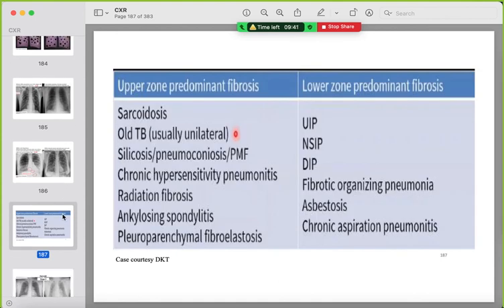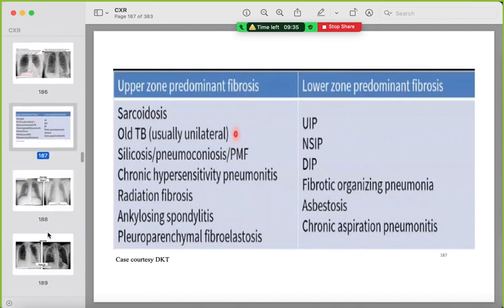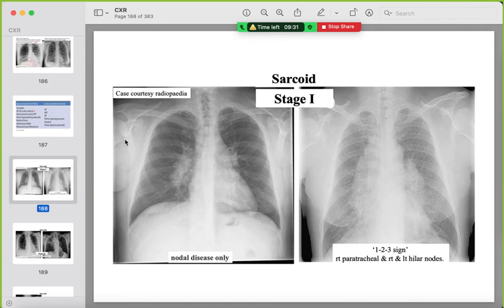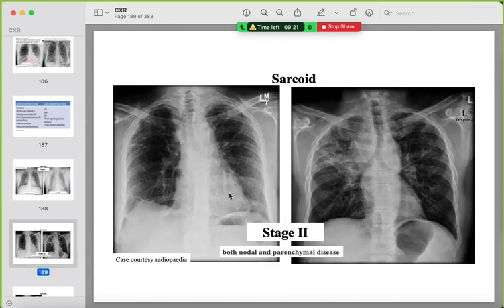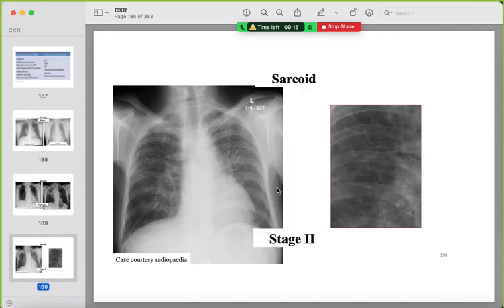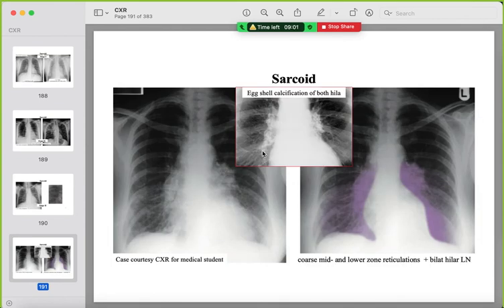Upper zone fibrosis causes include sarcoidosis and TB. Sarcoid has four stages: stage 1 is bilateral hilar lymph nodes and right paratracheal adenopathy; stage 2 is nodal plus interstitial/parenchymal lung disease; stage 3 is parenchymal disease without nodes; stage 4 is confluent fibrosis. Eggshell calcification of hilar lymph nodes can be seen. Silicosis is another differential.